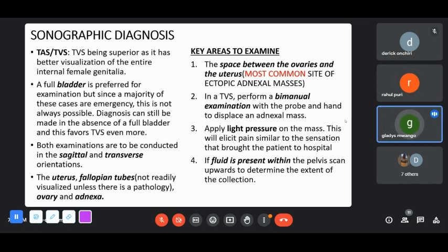One thing you can do is you change your megahertz. You go even lower on your megahertz. You could try that and see if you can get the imaging. That's what one can try.